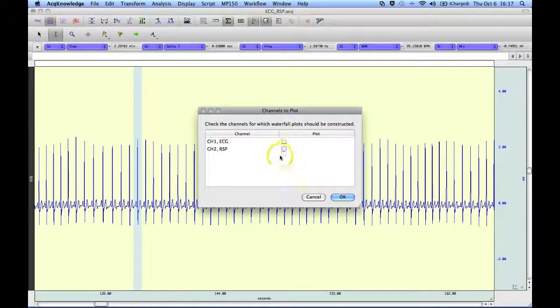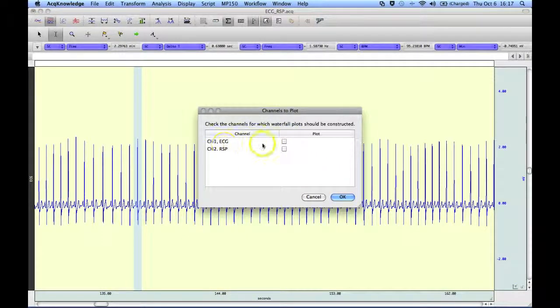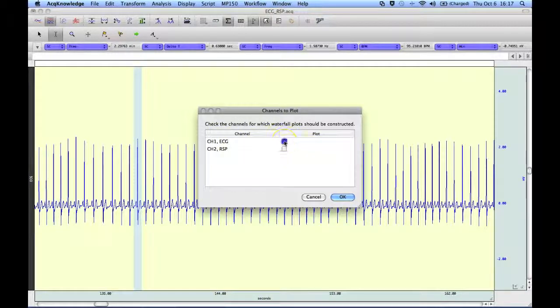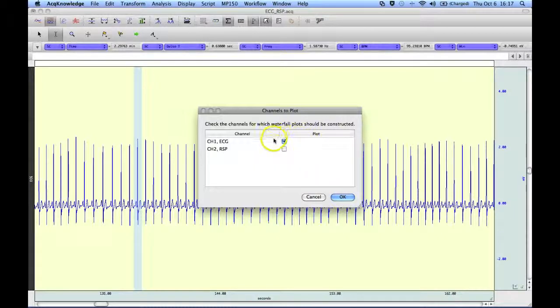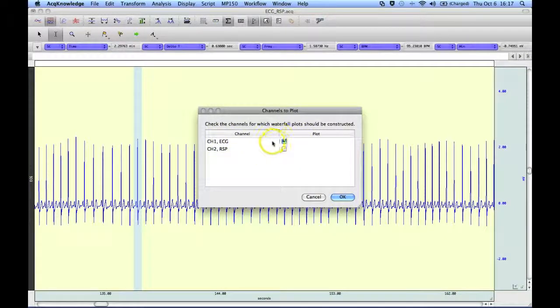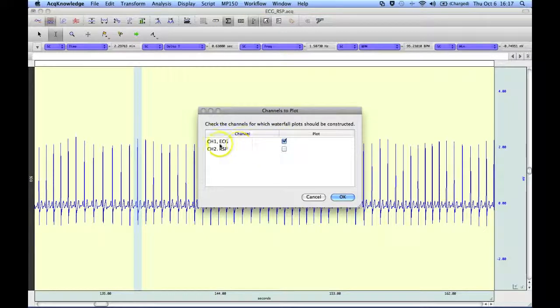And now it's asking me there are two channels in this file, although I'm only displaying one, which channel do I want to get an average from. So in this case it's going to be just channel 1 ECG, sorry not an average, which channel do I want to create the waterfall plot from, so it's ECG.